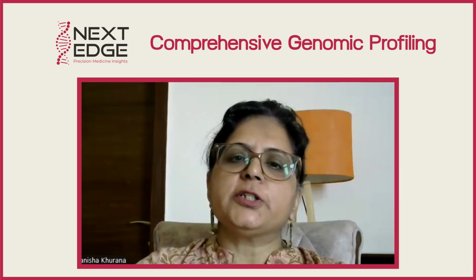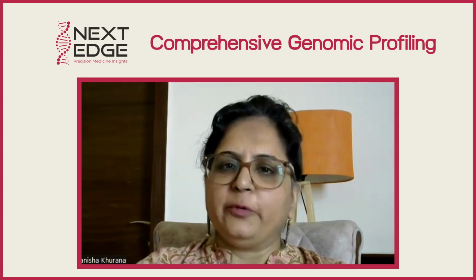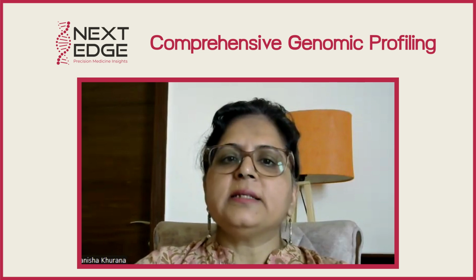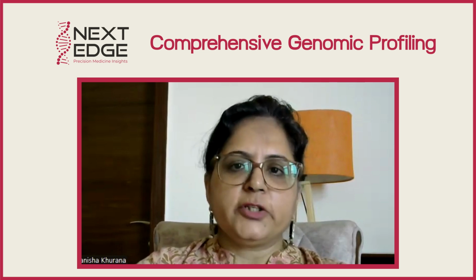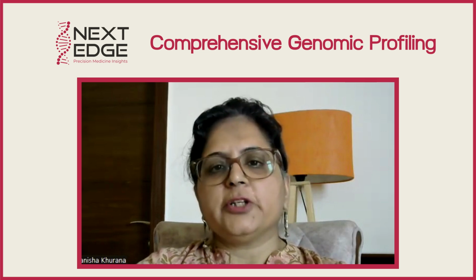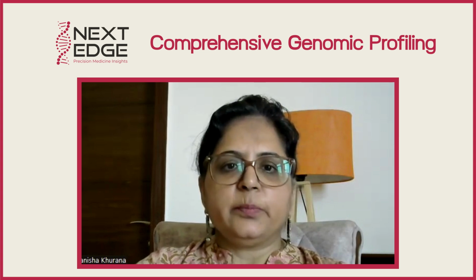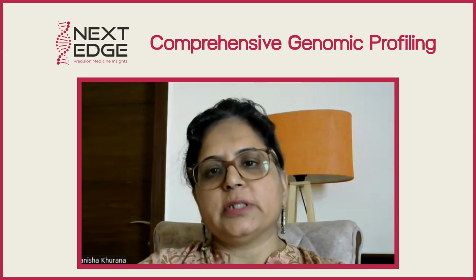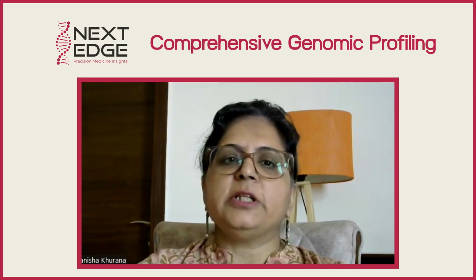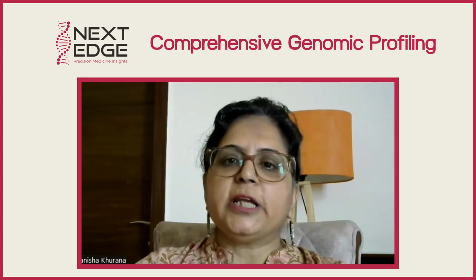Our topic of discussion today is comprehensive genomic profiling. Comprehensive genomic profiling (CGP) is an advanced diagnostic approach that analyzes a broad range of genomic alterations, including mutations, gene fusions, and copy number variations. CGP aids in personalized medicine, guiding targeted therapies and improving outcomes for patients, particularly in oncology, by identifying actionable genetic mutations.